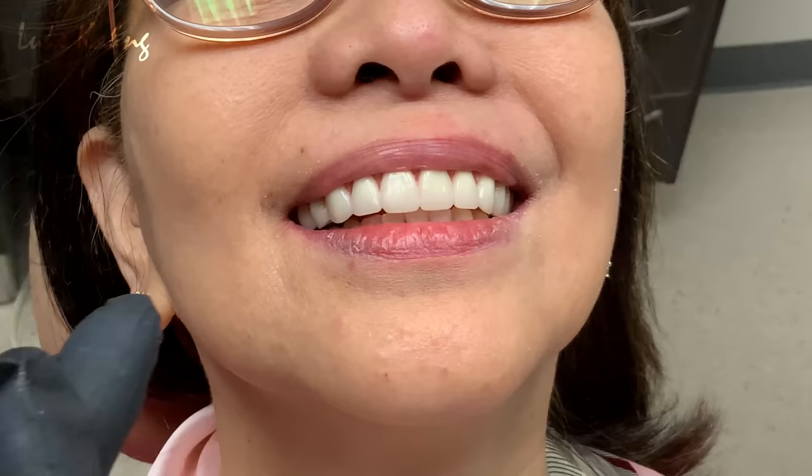Go ahead, smile. There we go. Come in from above so that you're right parallel with her. That's what you want to see. You want to see parallel. And from the sides, look. And then you can see, hold on, so you can see the face just like this, the midline, other things.